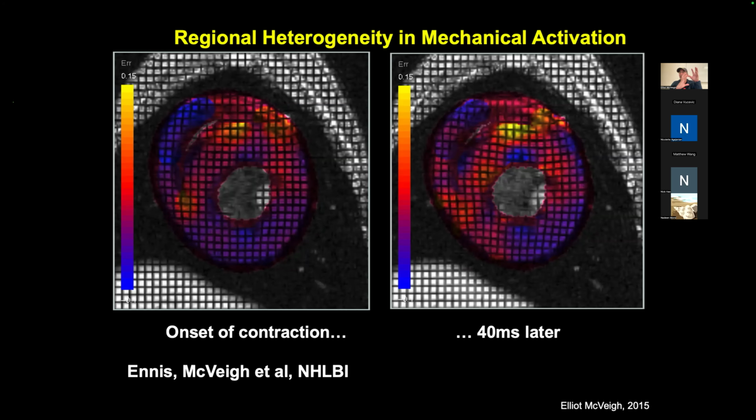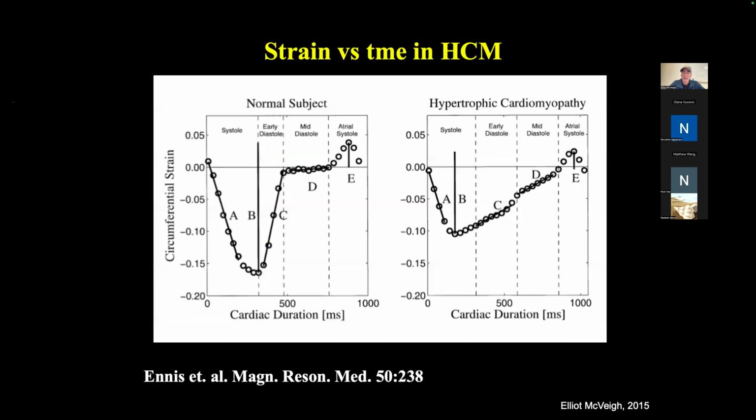You lost a certain amount of twist on the left ventricle very early on when somebody was going to go into this rejection phase. And so measuring strain makes sense for many things, for whether or not somebody's going into heart failure, whether or not the ischemia has resulted in a change in the myocardial strain, etc.